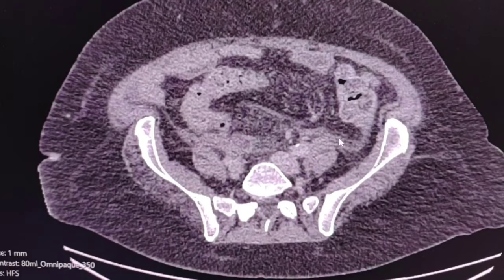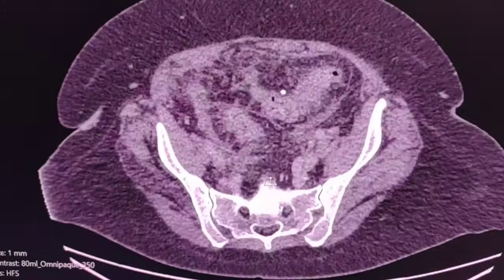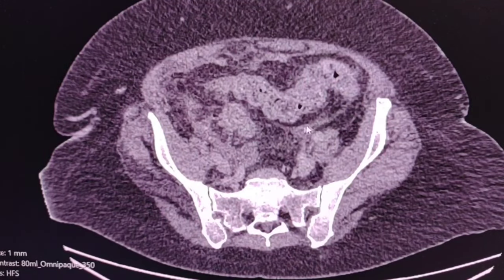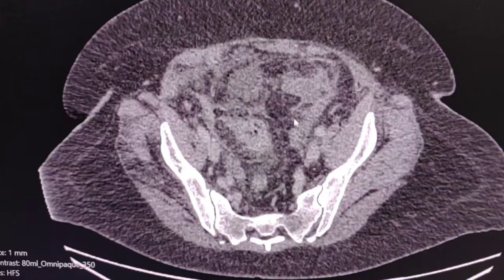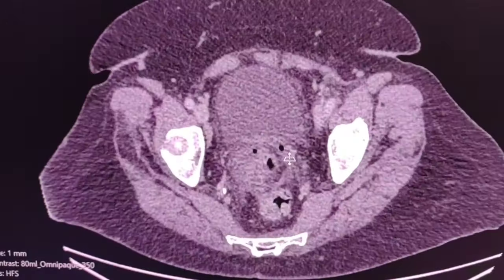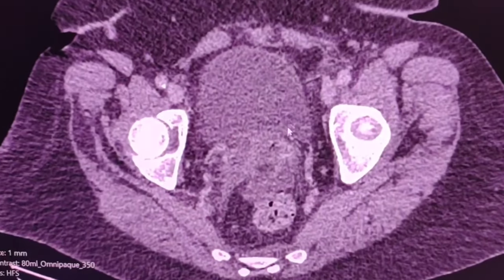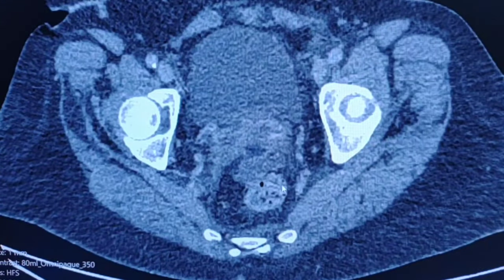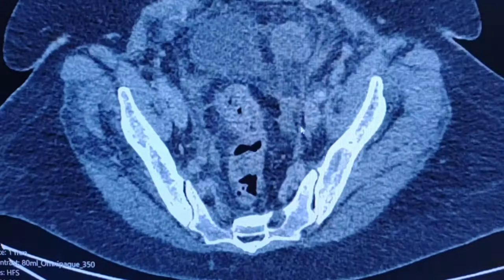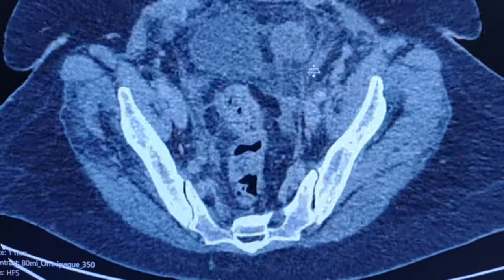There are some traces of fluid here and there, and there are some loci of fluid. This is anteriorly to the rectum. This is another fluid loculus.